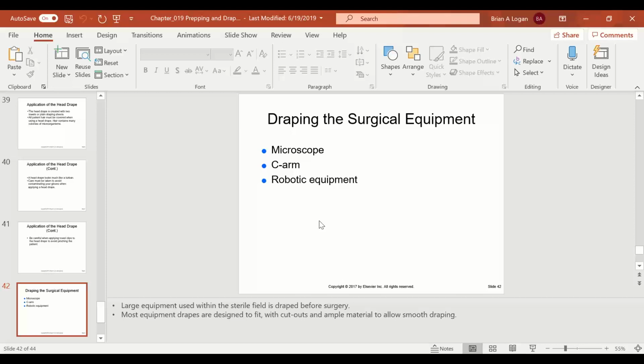The microscope is probably the most unfair thing to the vertically challenged in the operating room, and it was even for me. I'm almost 5'9". My nurses, they would set up, because they have to set up the microscope and do what's called a balance of the microscope and run it through all its boot up and stuff like that, and then get it to set up so that when the surgeon is controlling it, as soon as he grabs it and moves it into place, it doesn't try to drift on him and things like that.